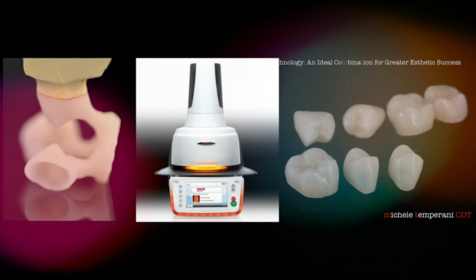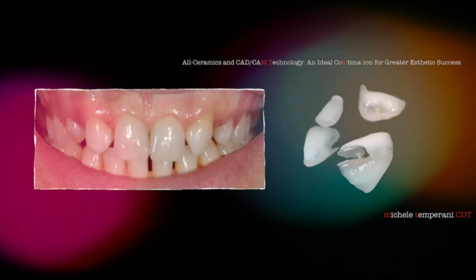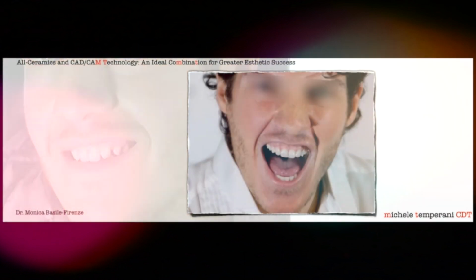Because today we have a new generation, the 4th generation of pressable furnaces. These furnaces work so well, it makes your ceramic so precise in the pressure and smoothness of the translucency of the material. It makes it easier to work. So from my point of view, I'm a practical guy. I like to do pressable veneers. I'm not afraid of doing it on the frontal teeth. I get a good result. I know that veneers done on feldspathic materials are probably better, but you achieve a great result also with this material. People are happy, and we are happy.